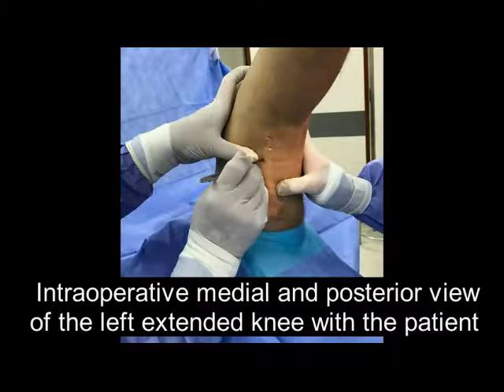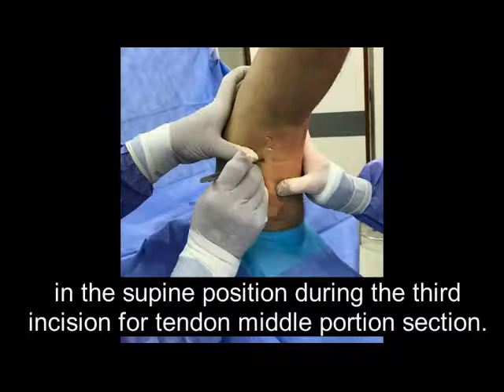Intraoperative medial and posterior view of the left extended knee with the patient in the supine position, during the third incision for tendon middle portion section.